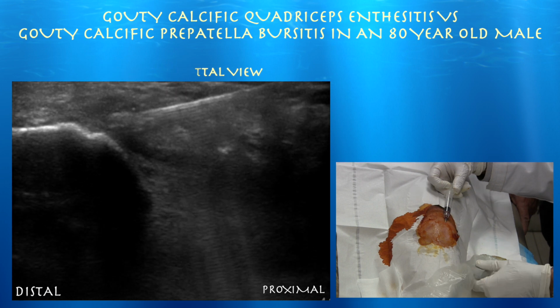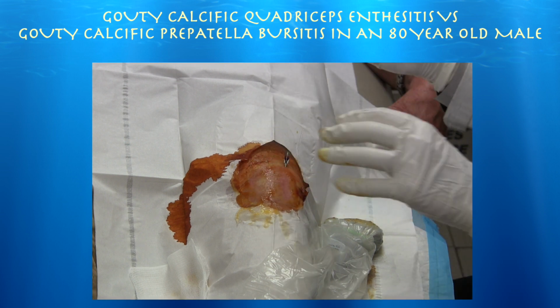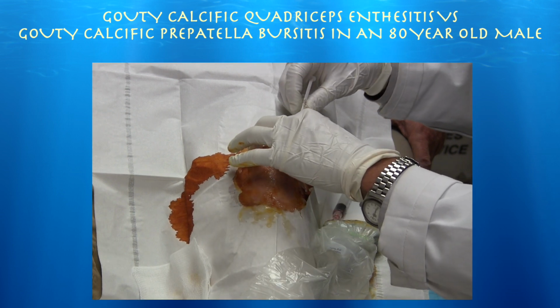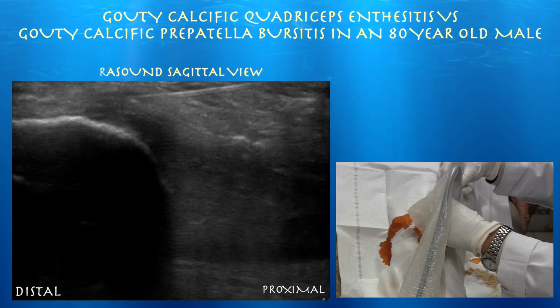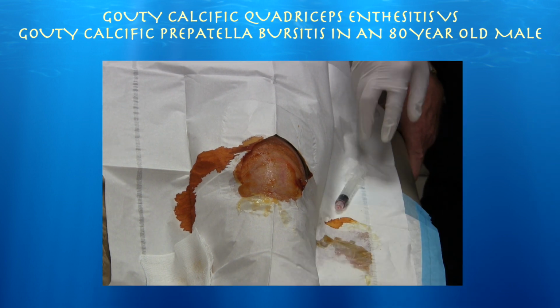You want to use that one? Oh, you don't like it. This will leave the cortisone. My glove was sterile, so it's okay to touch it over there. Just a little bit of cortisone. Just tell him not to do too much walking or bending or squatting.